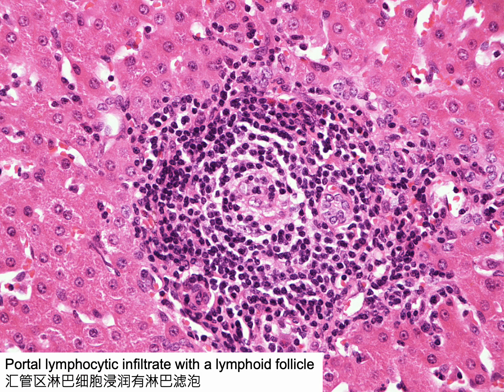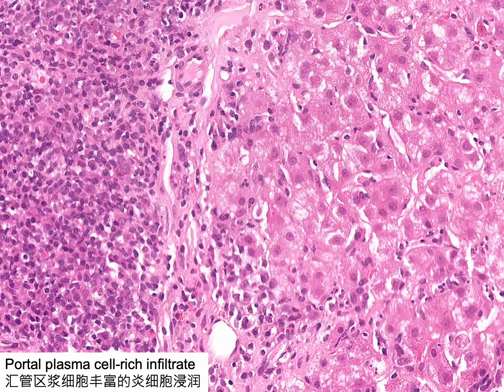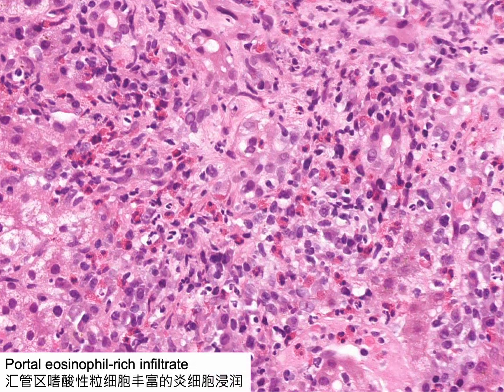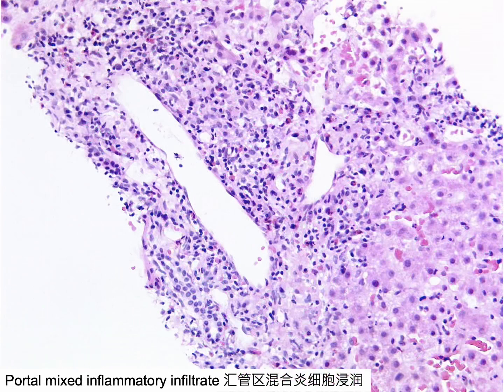Portal tracts may be expanded by lymphocyte-predominant inflammation with lymphoid follicle formation, or by moderate to marked infiltration of mainly small lymphocytes. Some portal tracts contain numerous plasma cells, a significant number of eosinophils, or many neutrophils. An interlobular bile duct infiltrated and distended by neutrophils indicates acute cholangitis. Portal inflammation can also consist of mixed inflammatory infiltrate including lymphocytes, plasma cells, and scattered eosinophils.